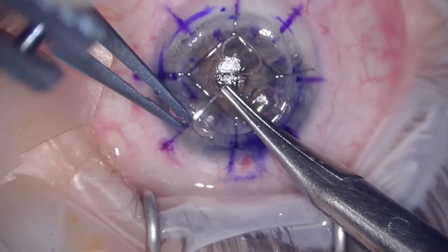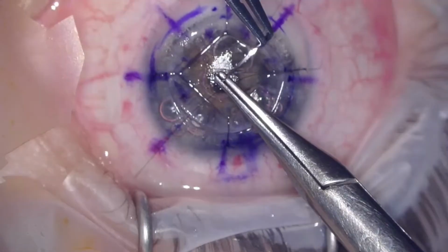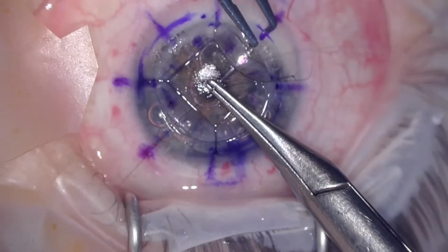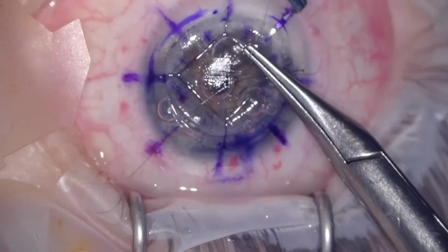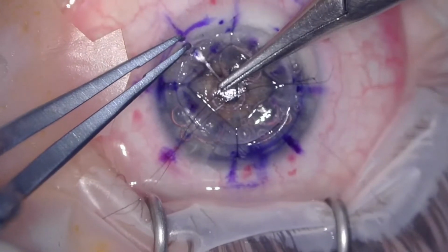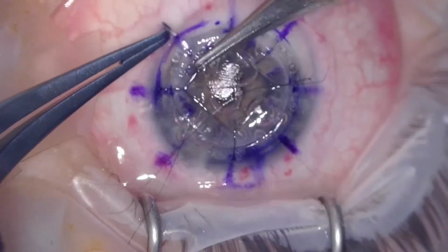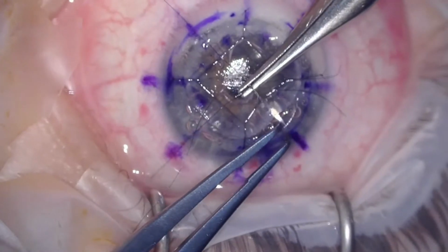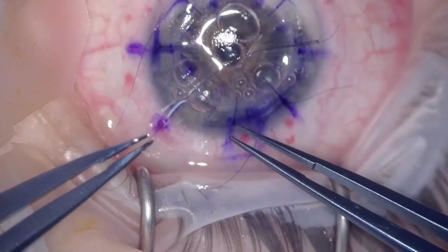Now I've cut the video a lot because I've shown you plenty of videos of me suturing, but this is just to show how I'm trying to be as accurate as possible with placement of sutures. So I'm using the edge of the diamond and the edge of the marking point from the trephine to use as a guide for my sutures. So you see I'm trying to make everything as equal and as regular as possible. I'm trying not to come out beyond the limbus to minimize any risk of bleeding. I'm trying to be very careful when I go through the donor cornea and down into the host cornea.